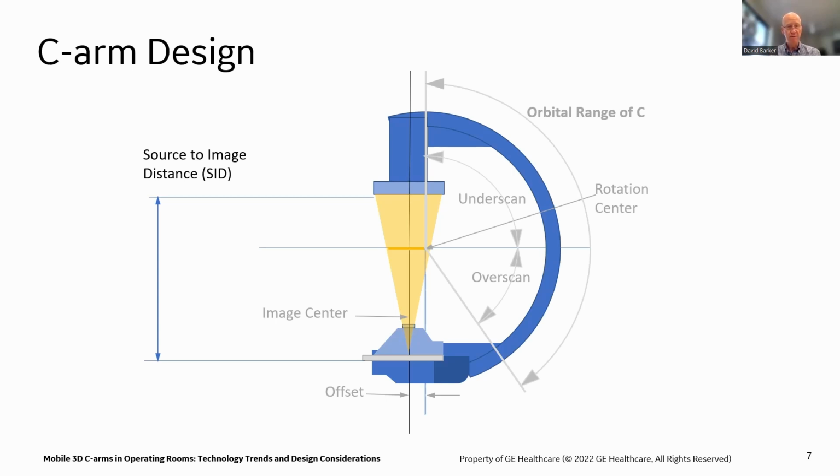You have to kind of trust the people who manufacture to understand what that is, because all the things that you really need to measure are under covers. The focal spot is obviously inside the X-ray tube, underneath the collimator cover, and the scintillator is inside the detector, which is underneath the cover inside the detector housing. So although it's a really common word that everybody likes to use, it's really impractical for people to try to go out and pretend to measure it.